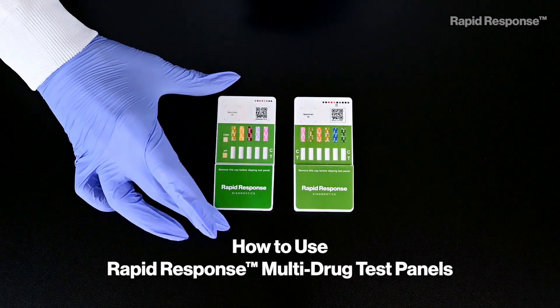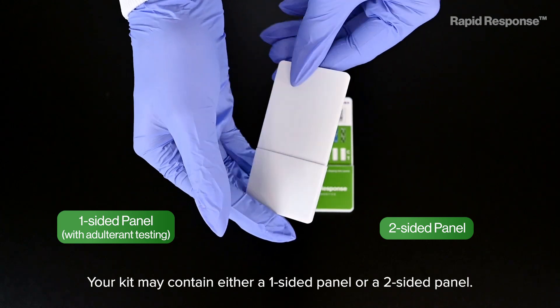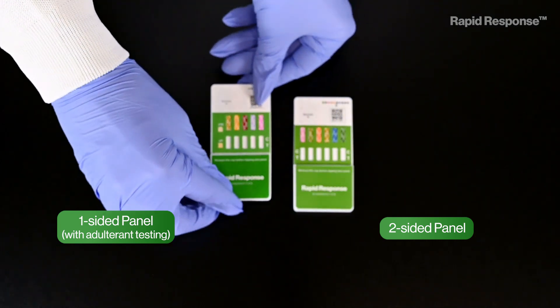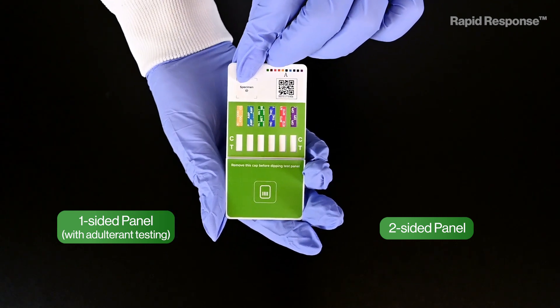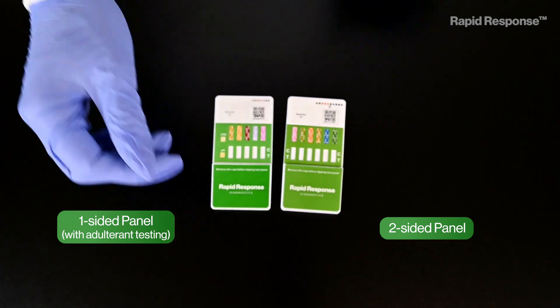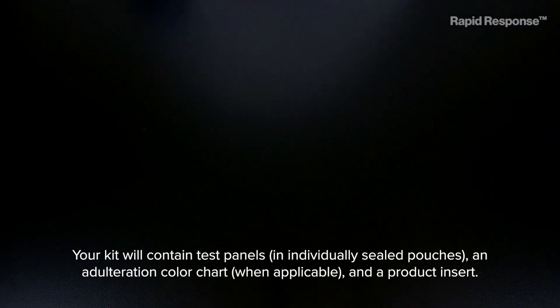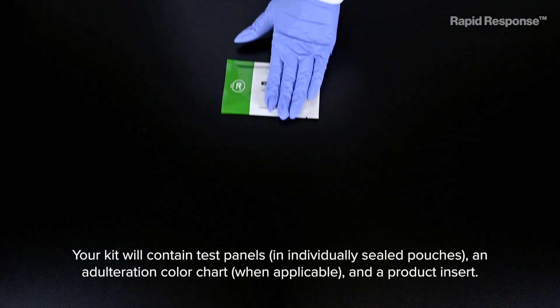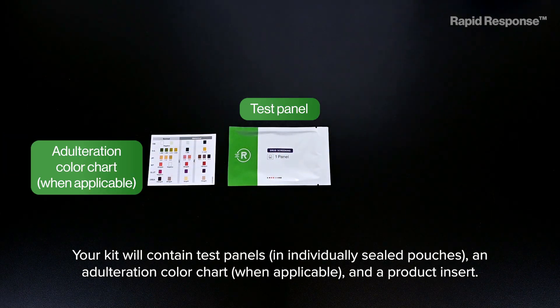How to use Rapid Response multi-drug test panels. Your kit may contain either a one-sided panel or a two-sided panel. The test panel and controls should be brought to room temperature prior to testing. Do not open pouches until you are ready to perform the test. Your kit will contain test panels in individually sealed pouches, an adulteration color chart when applicable, and a product insert.